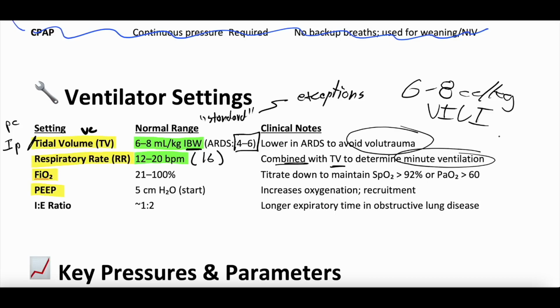So if you have someone who's in profound metabolic acidosis, their pH is very low, and what they're doing is breathing like mad to try to breathe off extra carbon dioxide, right? Try to have a respiratory compensation for their metabolic acidosis. I guess we're just full of plugs today, but we got a whole series on acid-base status too. If you're interested, check it out. But yeah, if someone has a profound metabolic acidosis, and goodness forbid you have to put them on a ventilator, just be really careful. They might need a much higher minute ventilation.